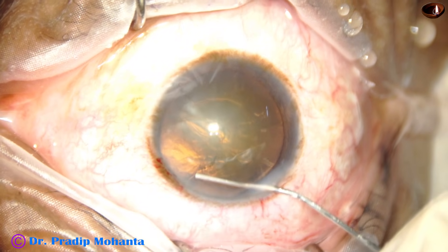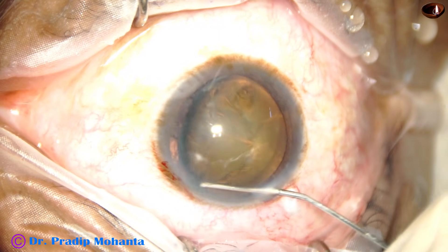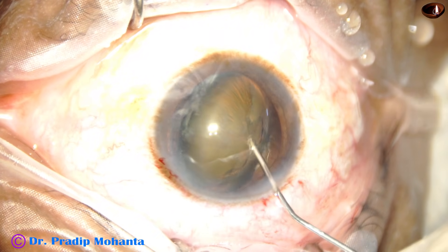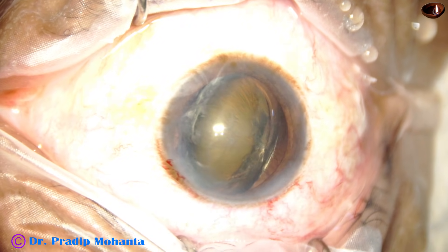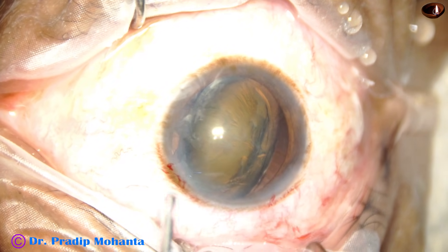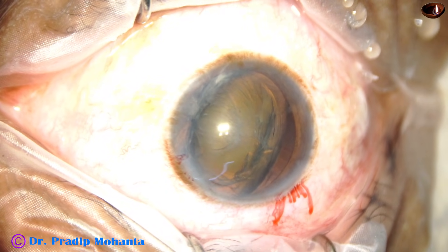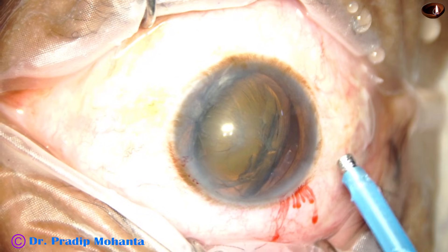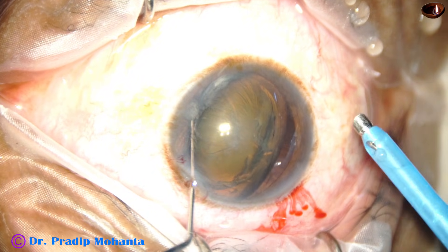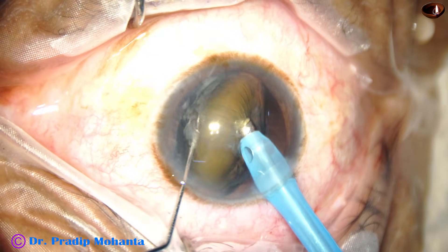As you do hydrodissection, keep injecting the fluid. After the fluid goes to the other side, the lens stands up. One part of the equator is now supracapsular. Now inject viscoelastic substance on either side of this standing nucleus. Take the chopper and support the posterior surface of the nucleus so that it doesn't go back again.